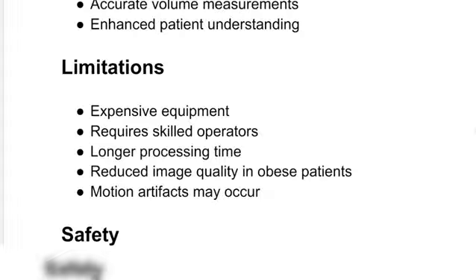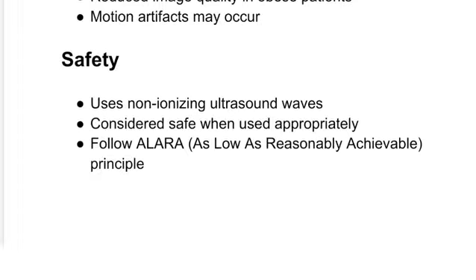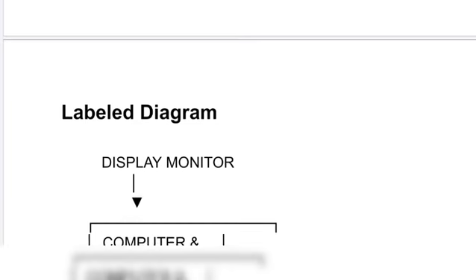Then what are the safety precautions? It uses non-ionizing ultrasound waves, so it is mostly considered safe, but when used inappropriately, it may cause damage. It also strictly follows the ALARA principle, that is, as low as reasonably achievable.